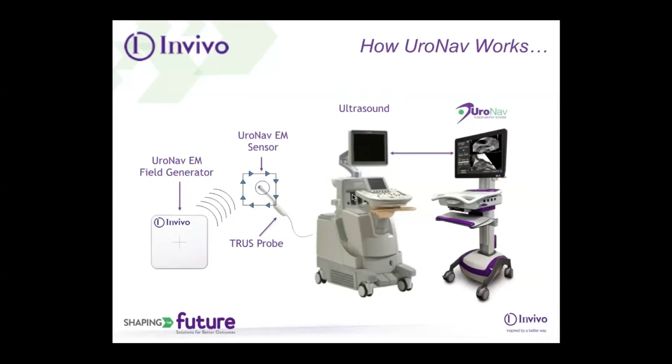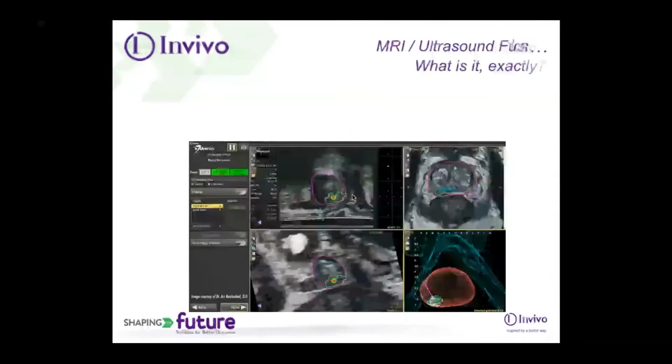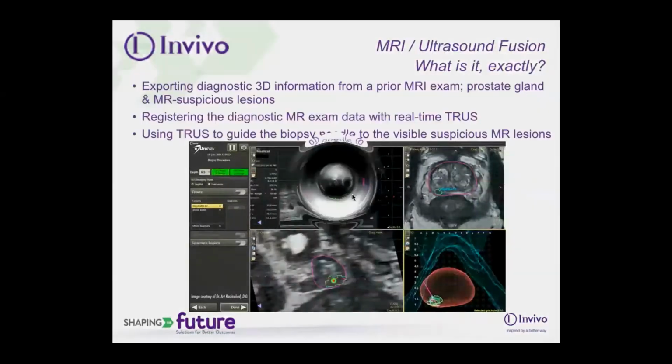We've done this in our clinics now for 5 years. And in terms of doing this, the important part is your relationship with your radiologist. In our practice, we're one of the first in the country outside of the NIH to bring the system into our practice. And we partnered with a team in the United Kingdom, which was very instrumental in beginning the MRI program from the radiologist. We partnered with them to get our protocols in place, and then we started the fusion program. And here's another image showing the same thing.